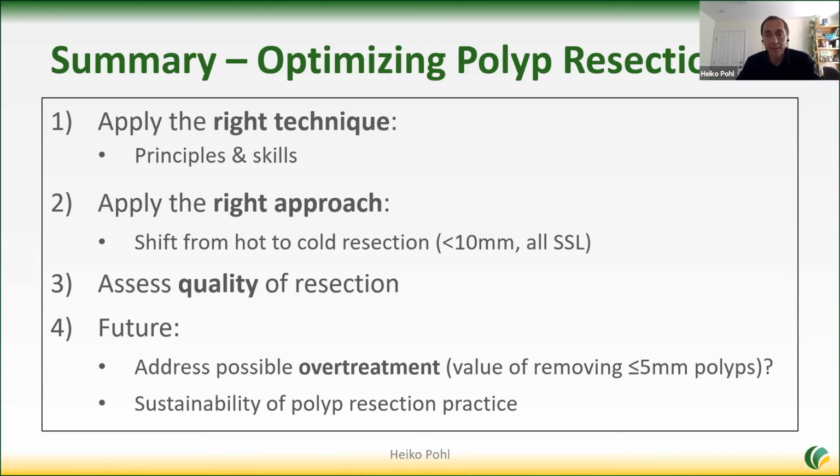I think it's definitely worth a trial to come up with an easy analytic approach. It's not as easy, but the bottom line is if you have a segment where you removed a polyp before, if it's incompletely removed, this will show up in the same segment later. So that's the basic idea about this.